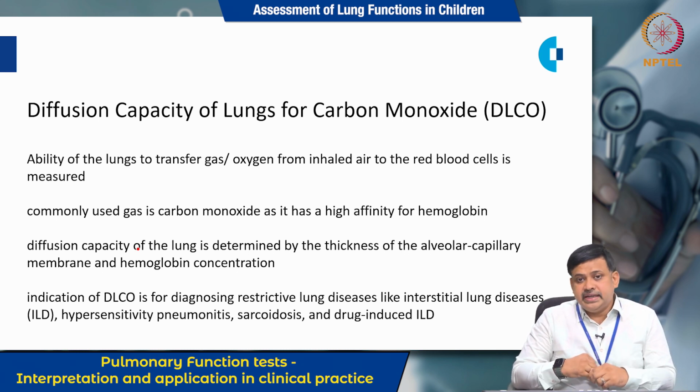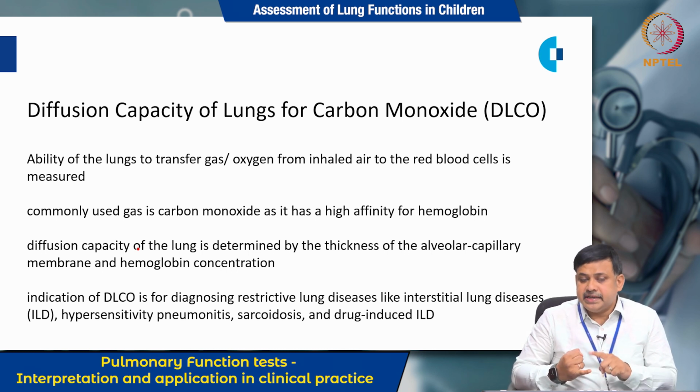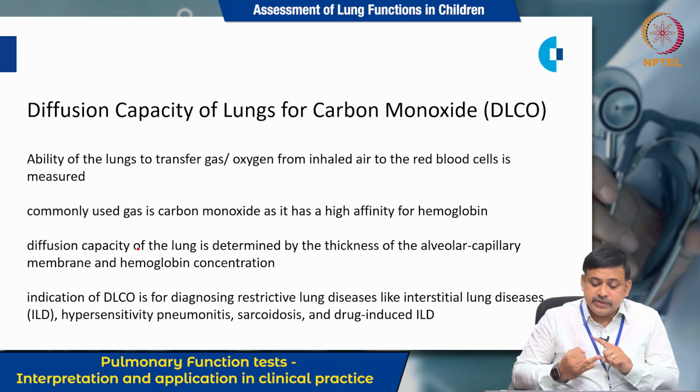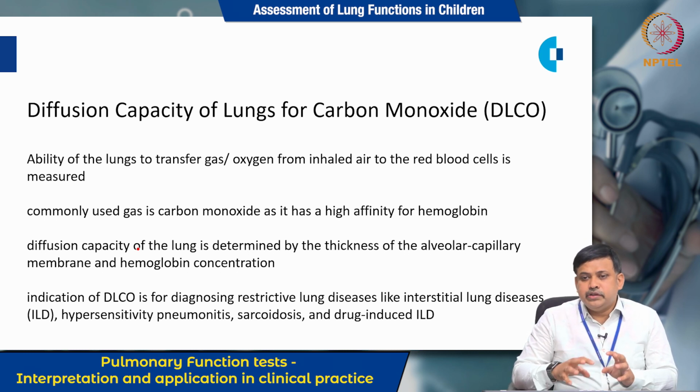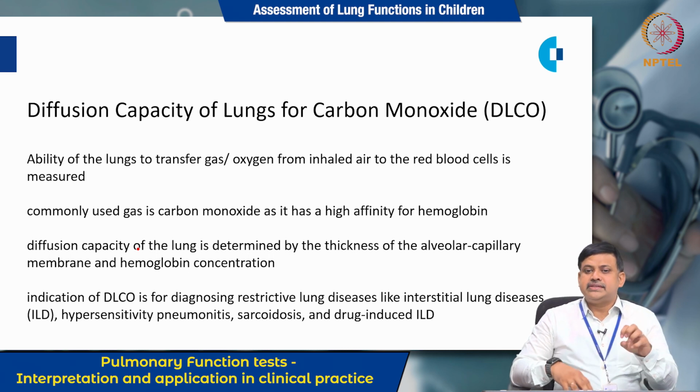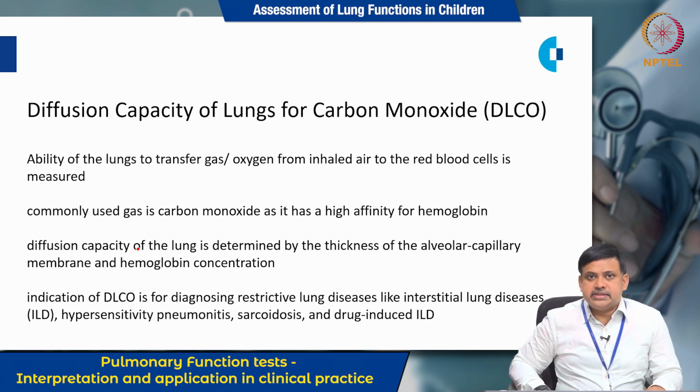The indication for DLCO is for diagnosing restrictive lung disease like interstitial lung disease, hypersensitivity pneumonitis, sarcoidosis and drug induced ILD. Even though these are not common in the pediatric population, if there are rare conditions, then we can do the DLCO methods.